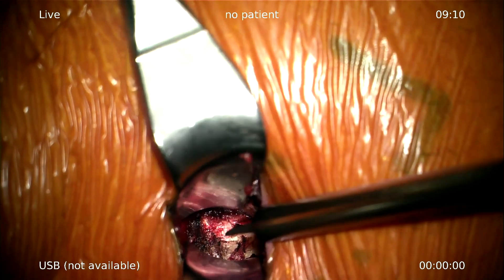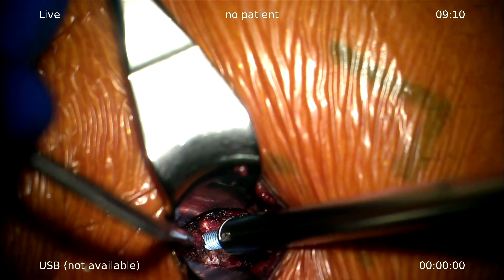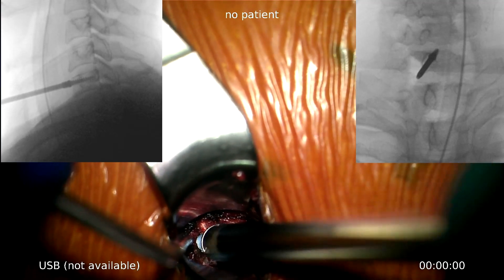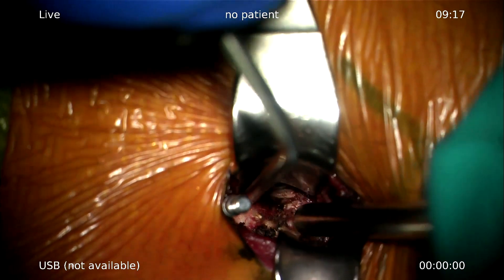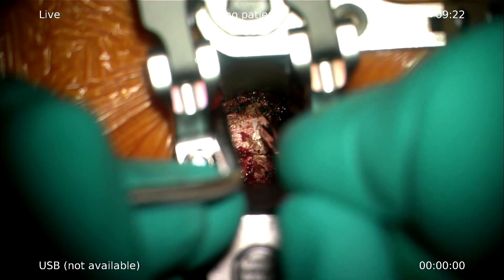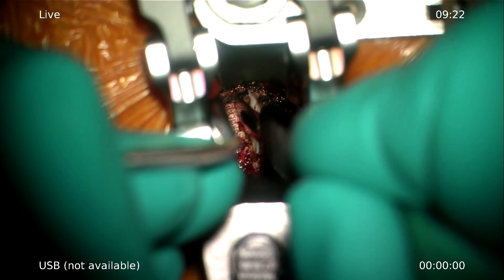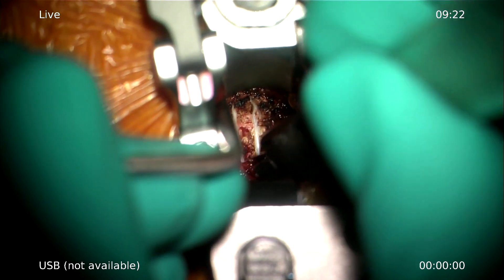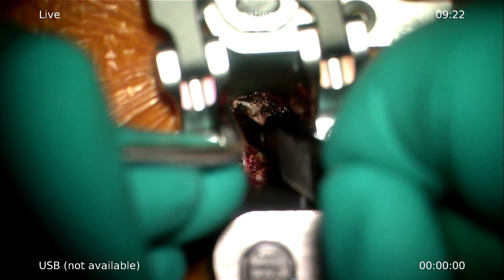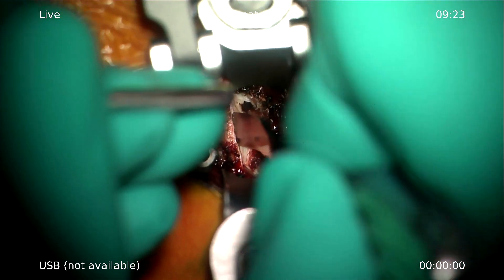We have screws — it's a 4.5mm retaining screw and a 3.5mm retaining screw. Now I incise the anterior aspect, the anterior annulus, all the way to the lateral. Cut only what you see, and I try to find the best plane immediately — then it's easy.